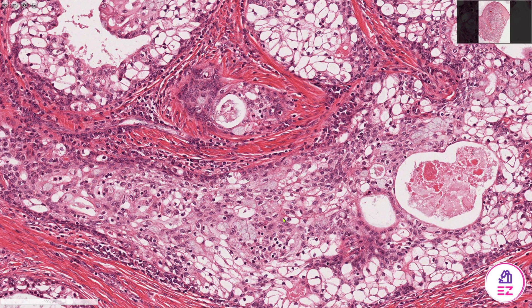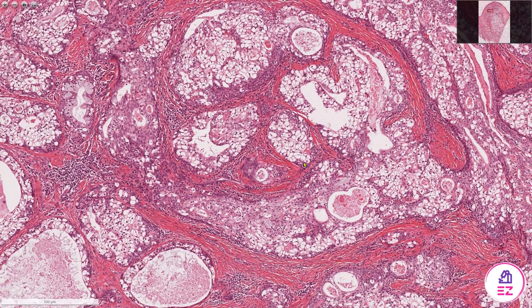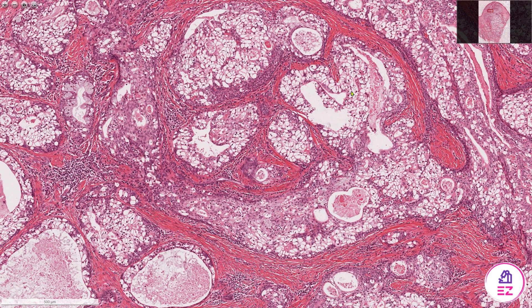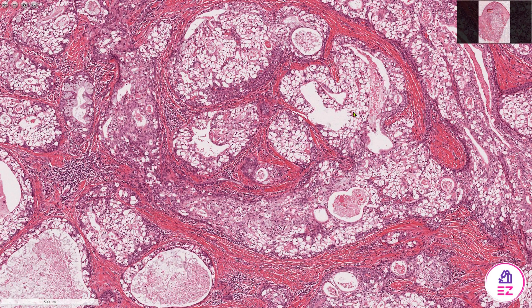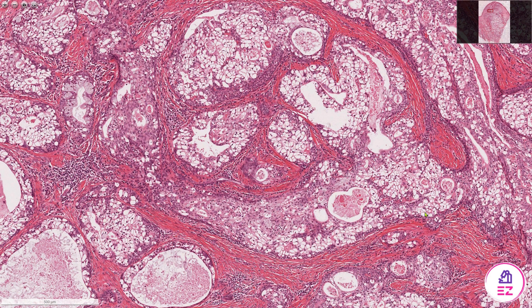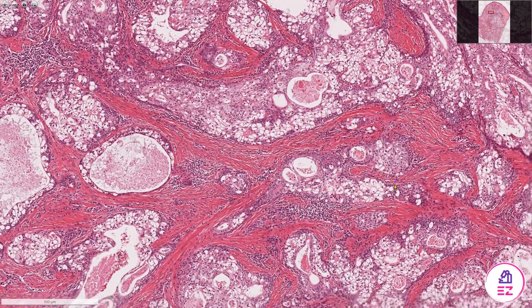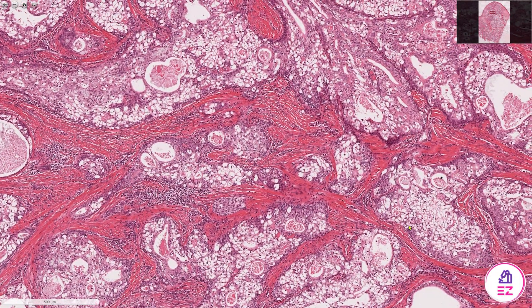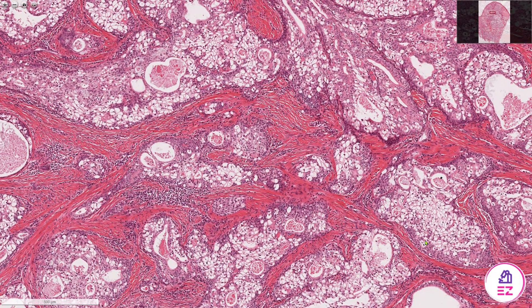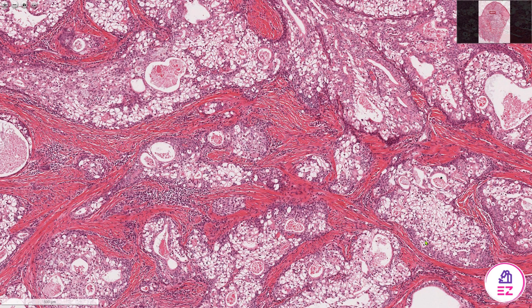Those observant amongst you will have noticed that we also have lots of clear cells within this particular example. These pale or white looking cells are due to glycogen accumulation, and clear cells are quite common within mucoepidermoid carcinomas.